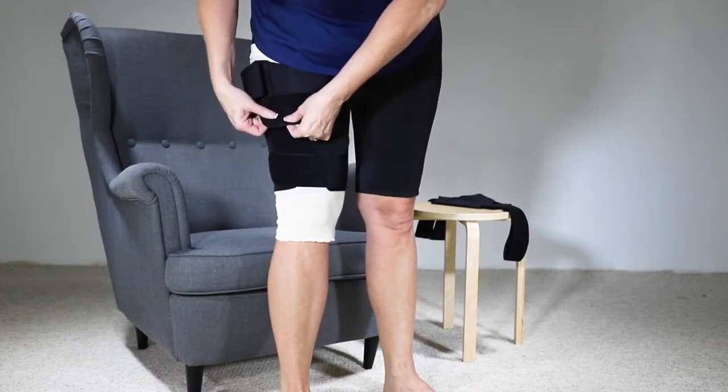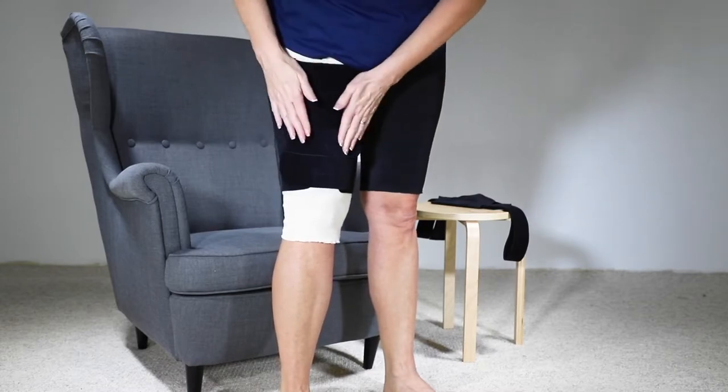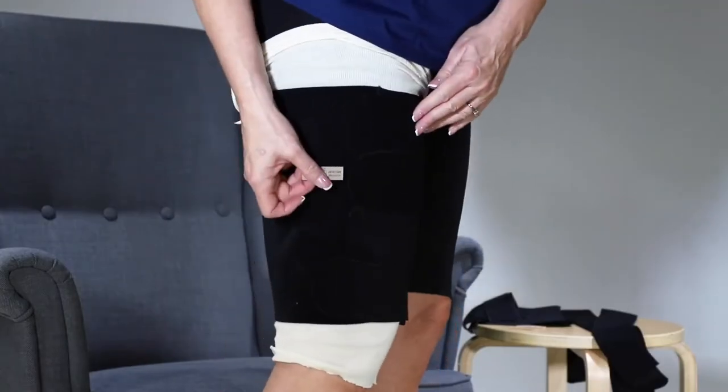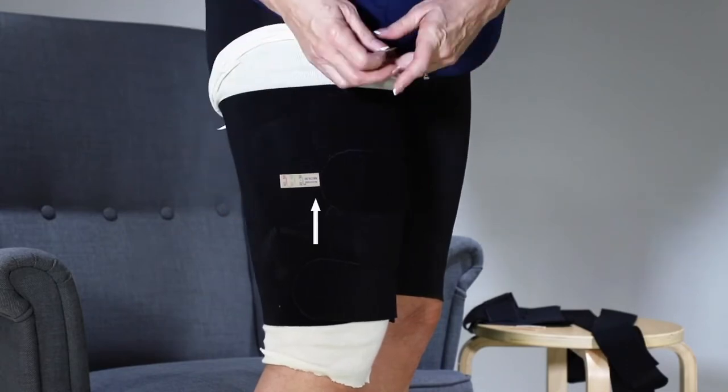Close the straps without applying any tension, making sure that they are flat without gaps. Place one AccuTab device per strap as shown here, making sure that the size and AccuTab are facing the strap.